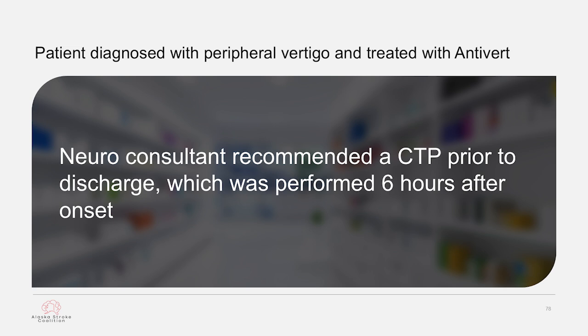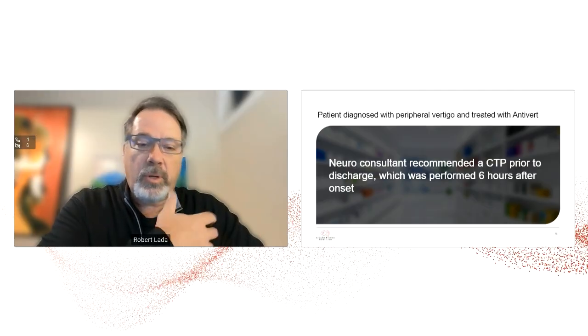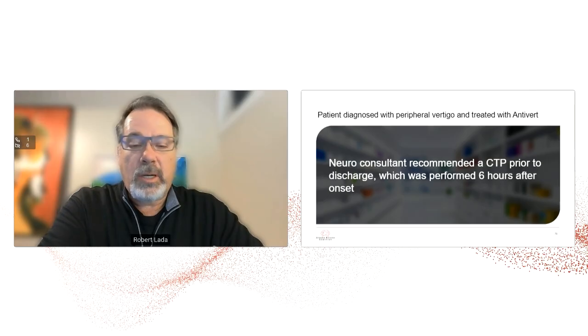So what is your differential diagnosis? What would you do next? Do you agree with the CT perfusion, Dr. Latta? Yeah, so we get this a lot, and I think it's probably one of the most frustrating and challenging diagnoses when someone comes to the emergency department, and we're on the telemedicine side, the ER doc as well. Dizzy, unbalanced patients go to the emergency department every day. And so how do you tease out the ones that you need to be concerned about?